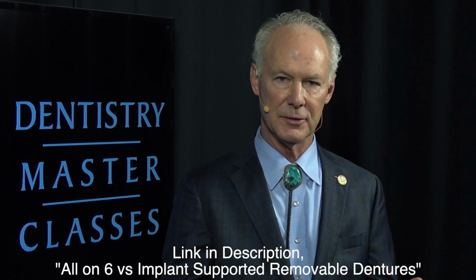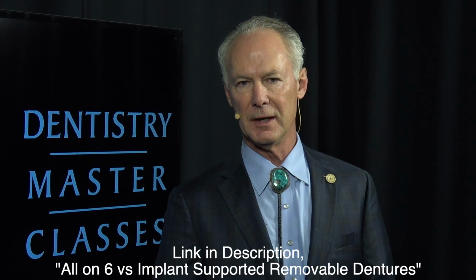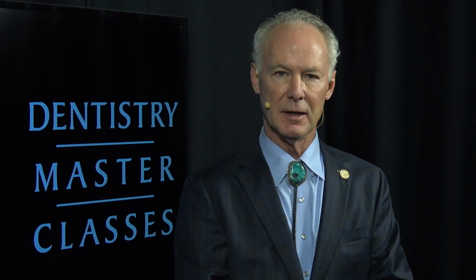We've also got implants retaining non-removable restorations called all-on-4 and all-on-6. So an implant's a wonderful thing because the bone grows into the implant if you give it time to osseointegrate. Now, I normally don't like to load the implant for about 3 months after it's placed. You think about a broken bone healing, it takes about 2 months. Well, I like to give it 1 more month so that you know the bone is solidly into the implant.